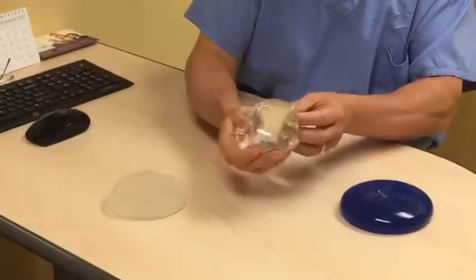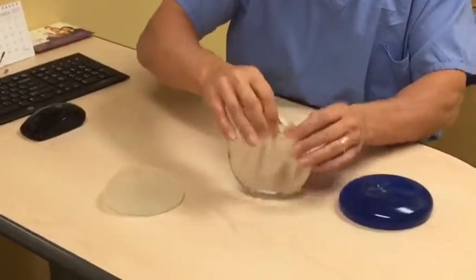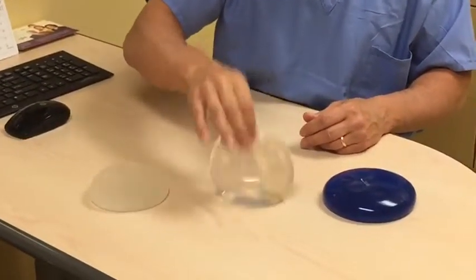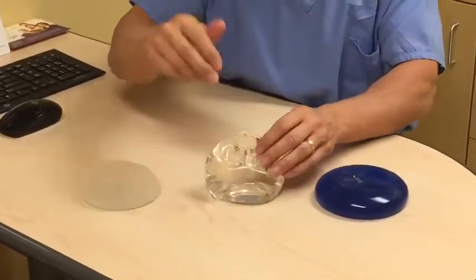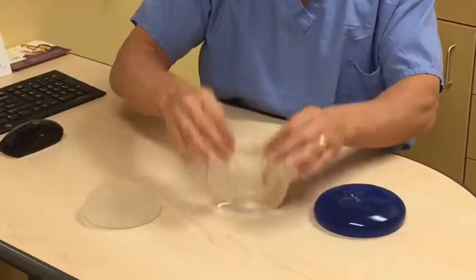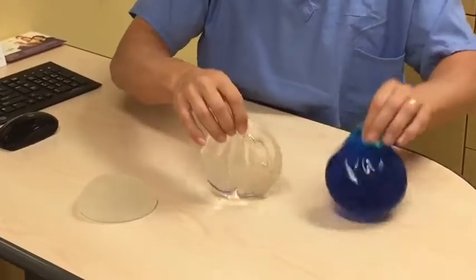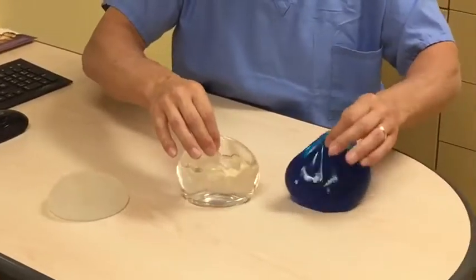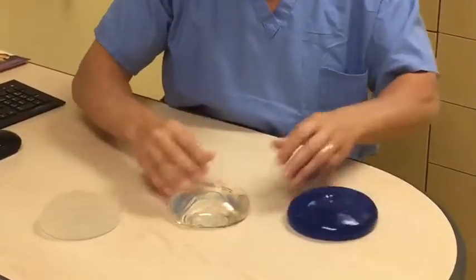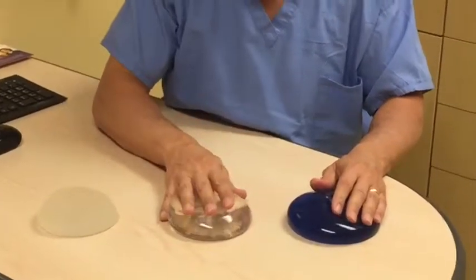Conversely, when you use a silicone gel implant, because of the nature of the gel inside the shell, when this has a downward directed force with each step of the patient, there's much less force directed on the bottom of the breast. Some of the force of that downward step, that gravity, is absorbed by the gel. So you can see the difference between the two here when you drop them both together. And this is one of the reasons why the silicone gel implant has an advantage over the saline device.